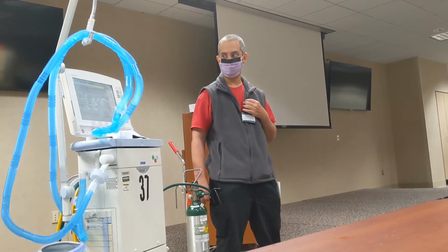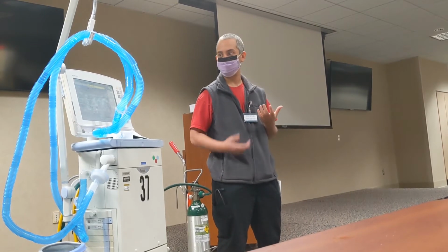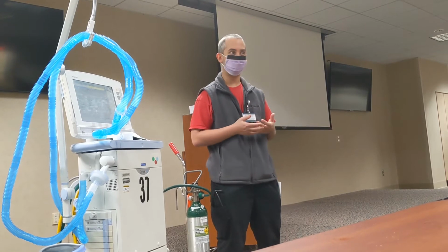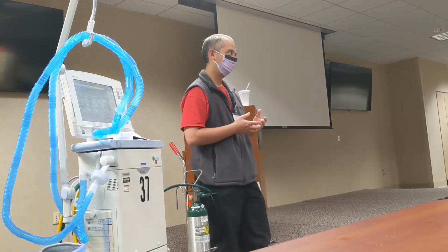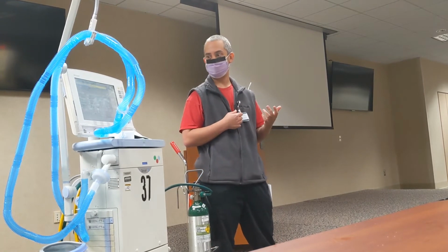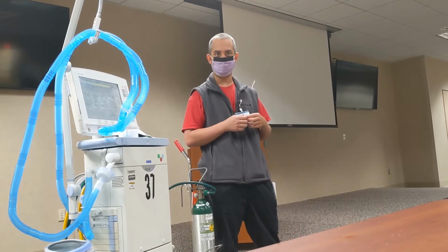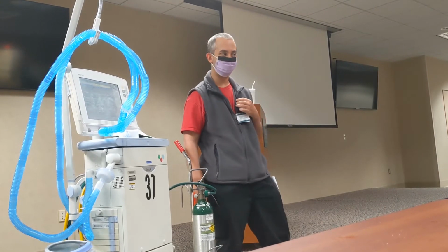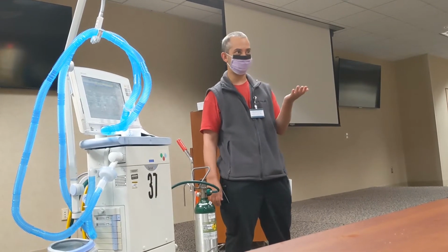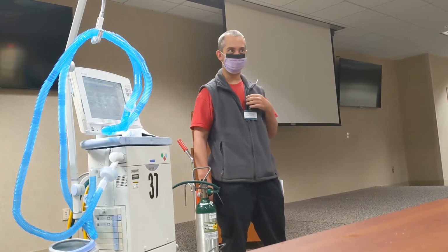Lung protective stuff with it. So there's a couple different ways to explain it. One is it's a pressure-based mode. So you can think of it as either pressure control with inverted inspiratory and expiratory times, with very short expiration and a longer inspiration. The other way you can think about it is CPAP, just continuous pressure with intermittent releases to get some ventilation.